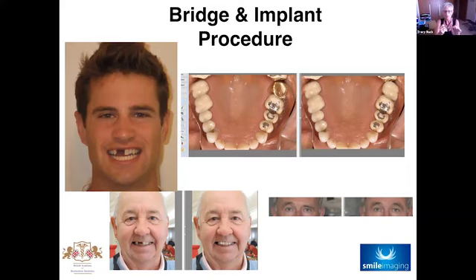As I said, bridge and implant is a copy and flip tool, and then replace the gold crown, and then you can size it exactly the same. Square boxes appear and you can size it into place. Same thing done with the eyebrow lift that we looked at earlier. Go around the good eyebrow, flip it over, and the same with the older gentleman there, replacing his teeth there.